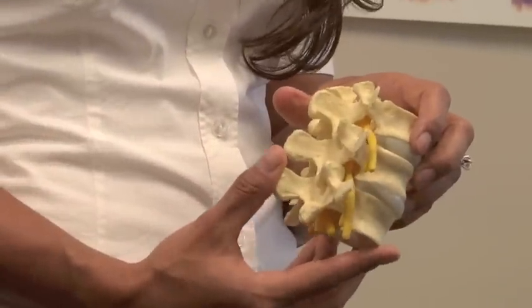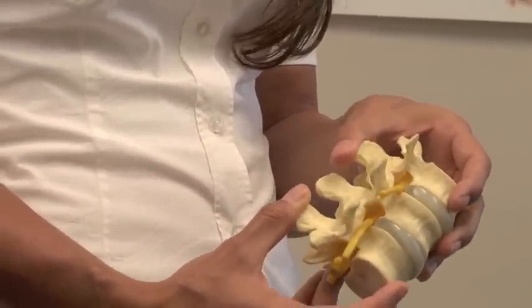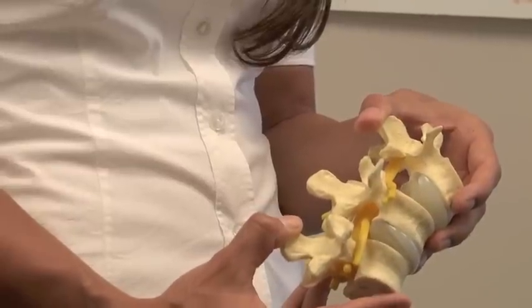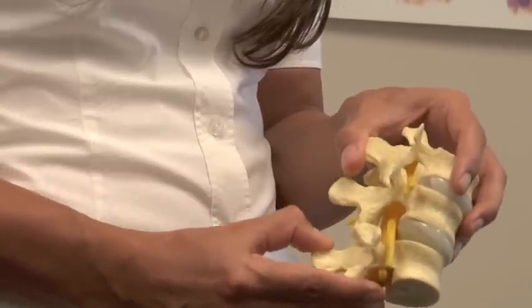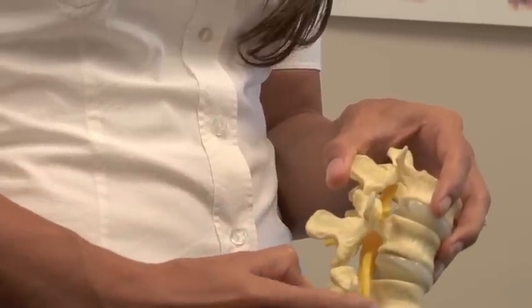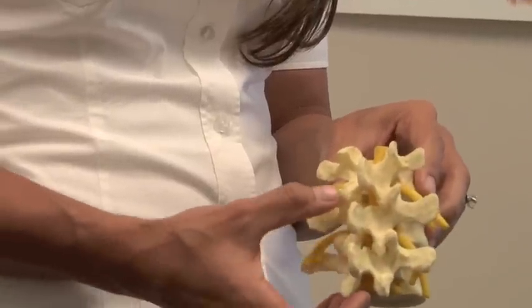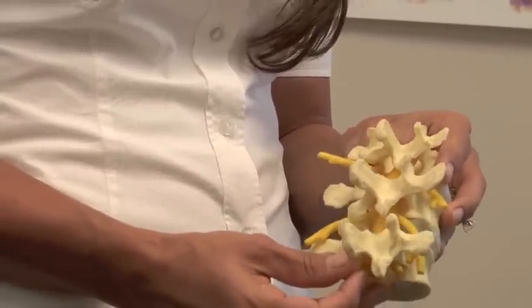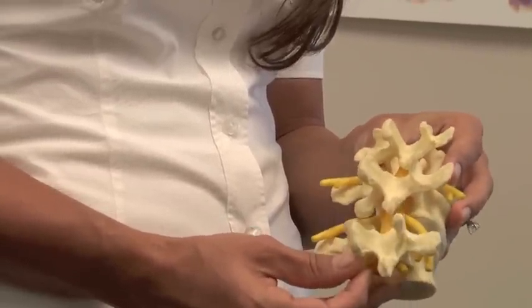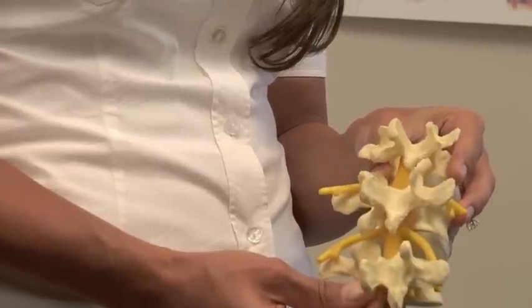With the use of a specialized table, we're going to introduce a lengthwise stretch for the spine, moving that disc away from the nerve. The foraminal openings here, which is where that nerve comes through, that area enlarges, which allows more space for that nerve to come through. Additionally, the facet joints in the back of the spine, they separate, which helps take pressure directly off the nerves, pressure off the joints, and actually restores normal range of motion within the joint.